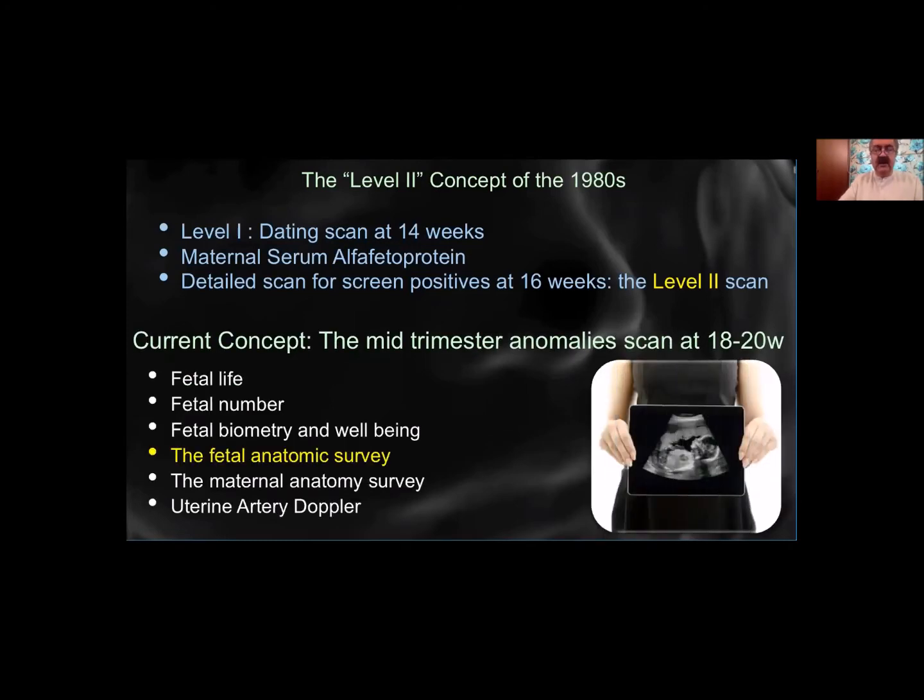We look at whether the fetus is alive or not, of course. The number of fetuses, in case they've been missed earlier and there is more than one fetus. And if we find two, we look for the third one and so on. We do biometry to check the growth as well as dating the pregnancy, in case the patient has not had a scan before. We watch movements and cardiac activity.